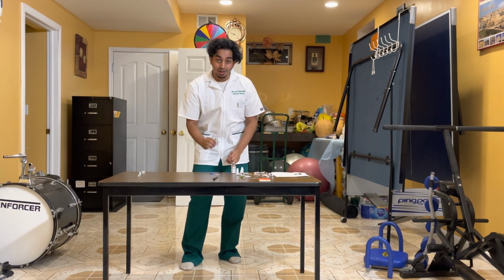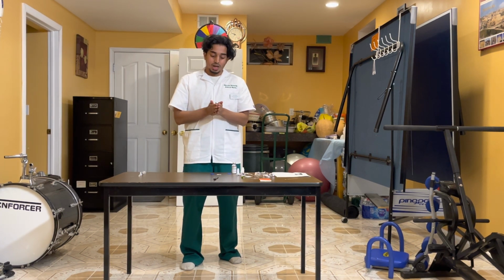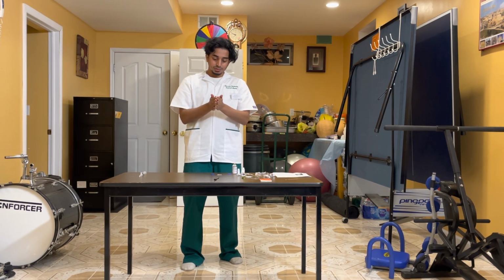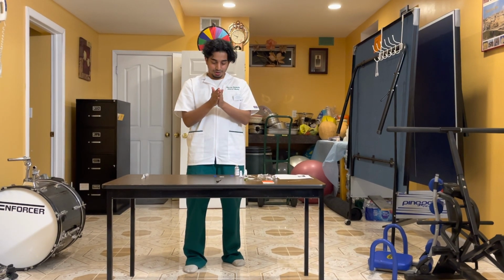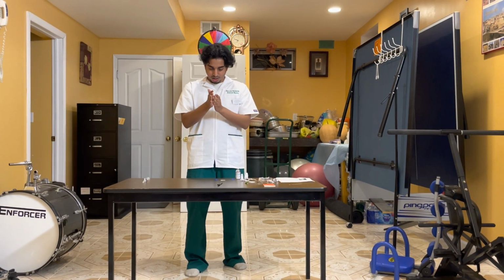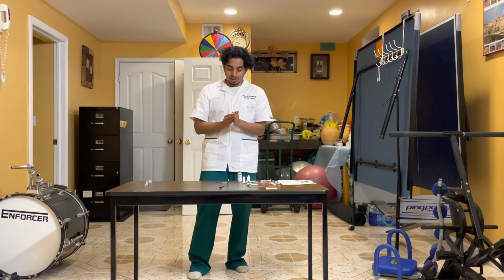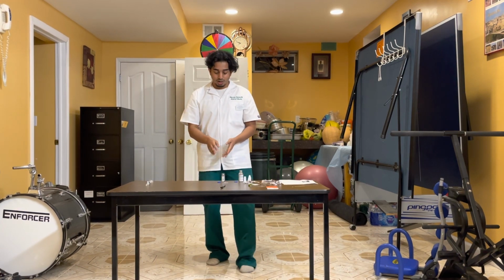And I take the medication that I have and I mix it. I mix it to make sure that it is diluted. I make sure that there's no particles remaining of the powder. Okay, I can swirl it a little bit. Now that's perfect, the vancomycin is perfectly mixed.